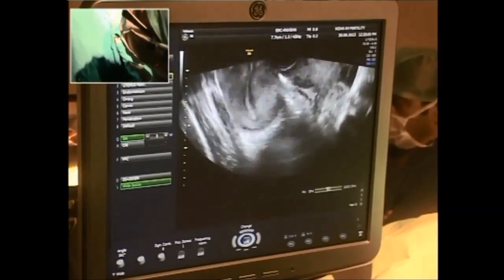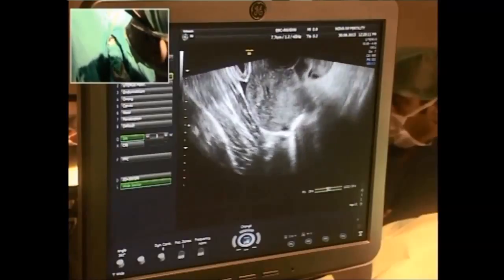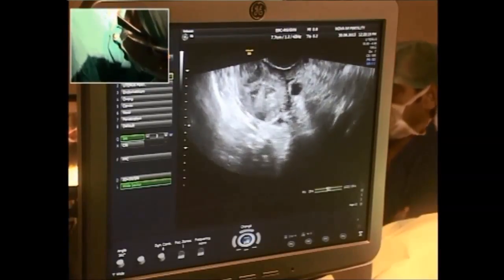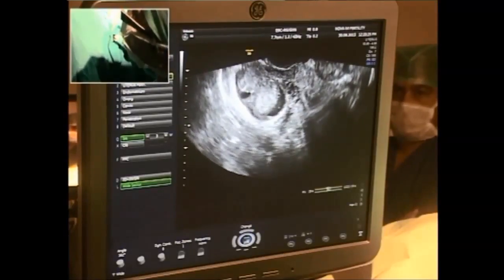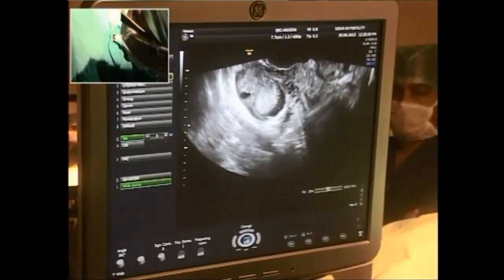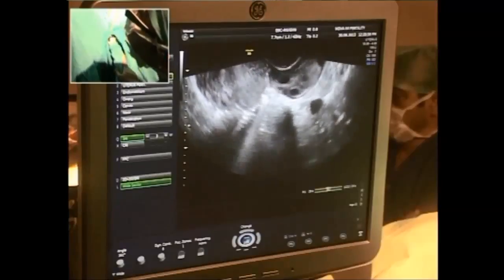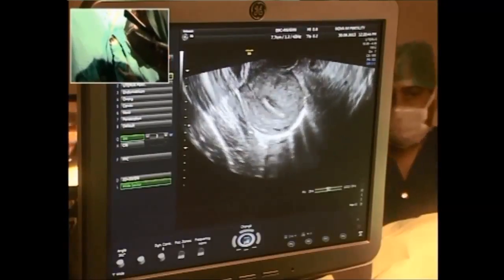Follicles less than 12mm can have a side effect of puncture, so you can leave them. Regarding the whitish hematoma-like shadows left behind after ovum pickup — not at all worrying. Once you've taken out the fluid, the capillaries ooze and show as these collections. It's an indicator that you've gone to the follicle properly. They all resolve on their own within two to three weeks.